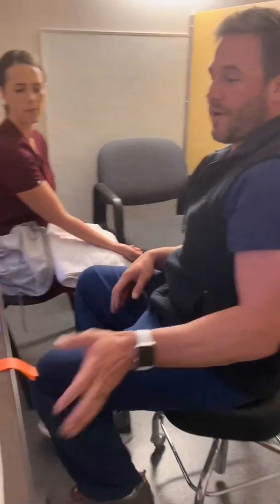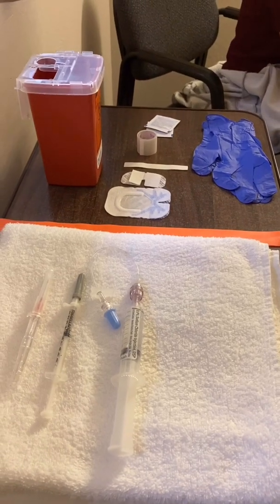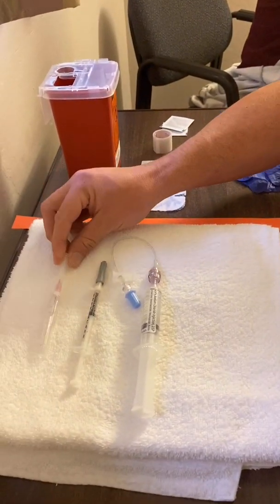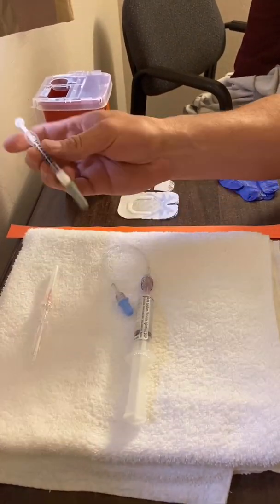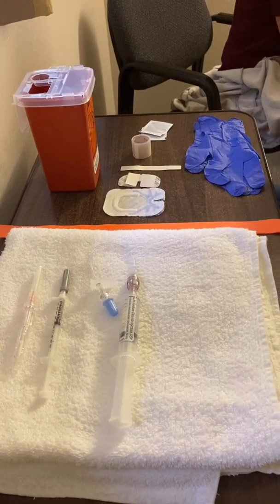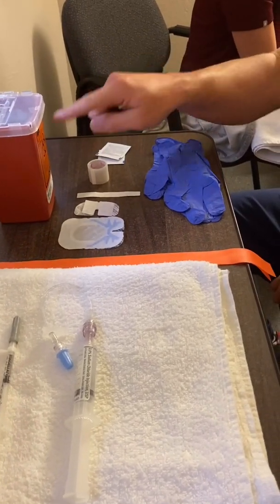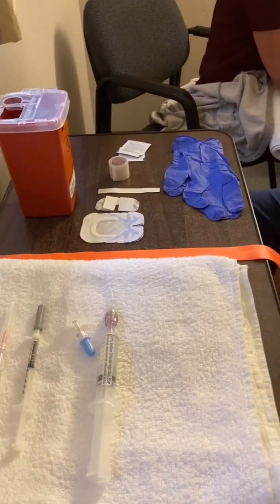So let's start off with our supplies here. First thing is to have everything out that you need. We have here our 20 gauge needle. We have lidocaine, which I'll explain as we go along. We have our saline lock, the flush. We have our Tegaderm. We have our tourniquet, our tape, our alcohol, gloves, and our disposable hazard waste.